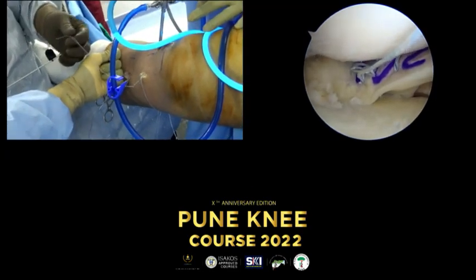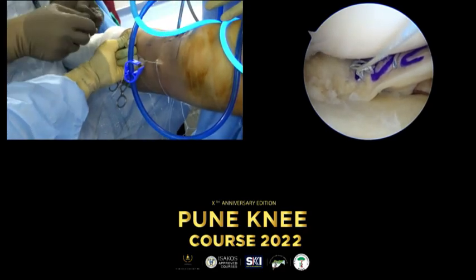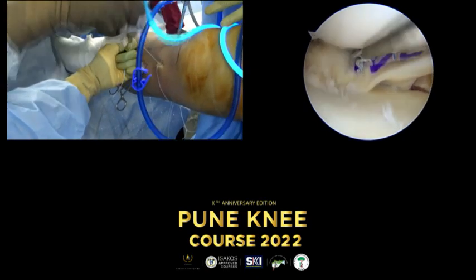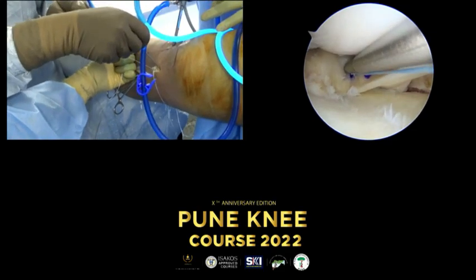Yeah, that's very important. They are under tension, but still I prefer to do it at the last moment because the roots are the more important fixation points, so I prefer to do it at the end.